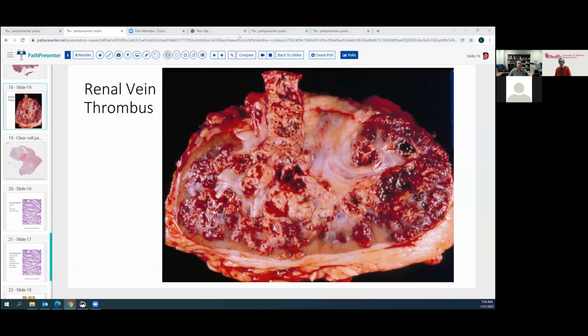Okay, was there another question? Yeah, Laura, Kalyani asks if there are any clues that would point to urine exfoliation of clear cell renal cell carcinoma. Would you usually expect that to just be sort of atypical cells for the Paris system, or would you report that as some other category?